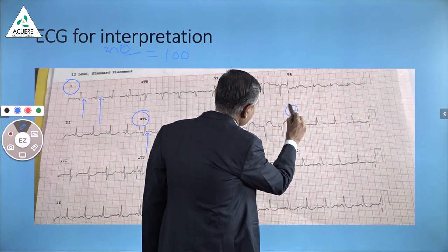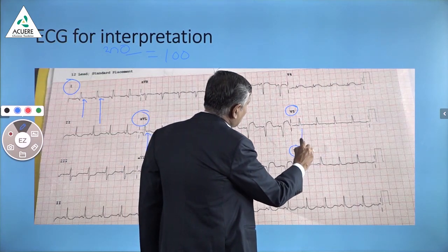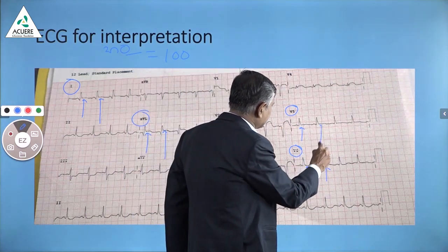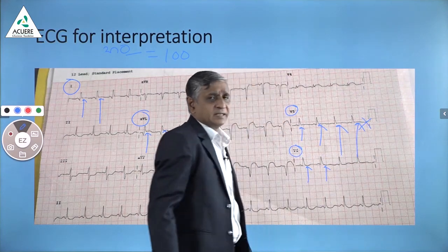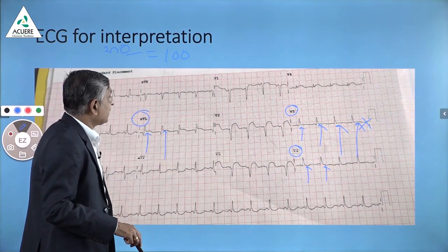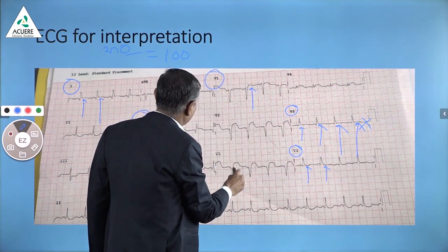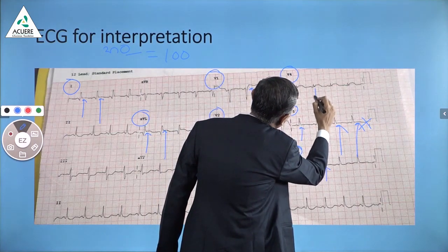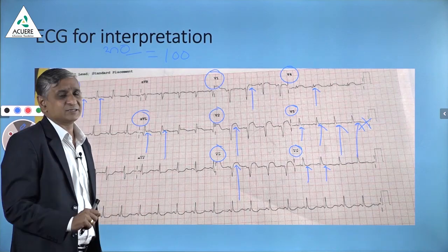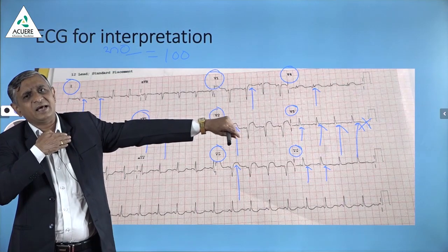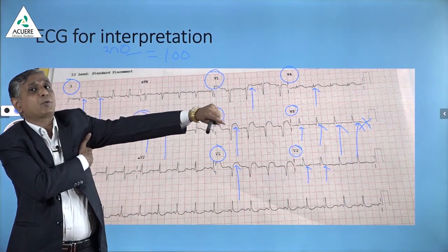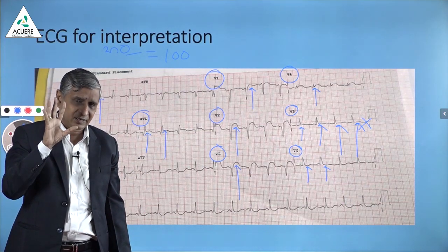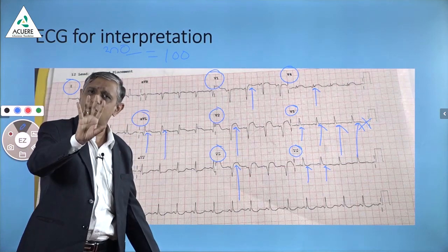One must also check V4, V5, and V6. In V5 and V6, there is not much ST elevation — in V6 it is not present, and in V5 it is questionable. So ST elevation is seen only in lead one and AVL. However, in V1, V2, V3, you can see ST elevation very clearly, and in V4 it is there but not so marked. The upper lateral portion of the heart is affected, but not the lower lateral portion represented by V5 and V6.